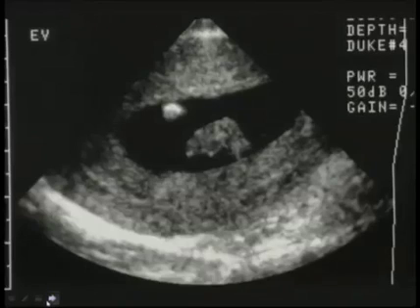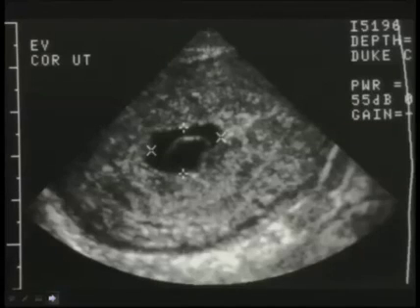Here's an example of the calcified yolk sac. Here is the fetus here. You can see from here to here. And this is the yolk sac to one side of it, and you can tell right away that it is very echogenic and small. And of note, you do not see a very distinctive shadow from this. Often you do not see that very weak shadow from it, but that should not dissuade you from making the diagnosis. Here's an example of a yolk sac that is crenulated and irregular.